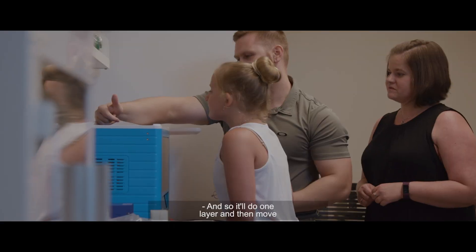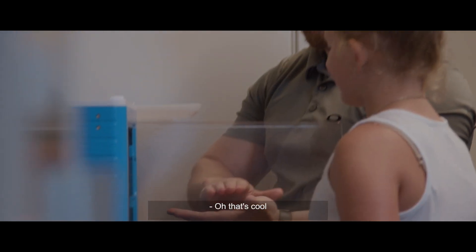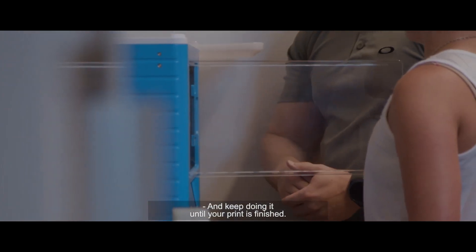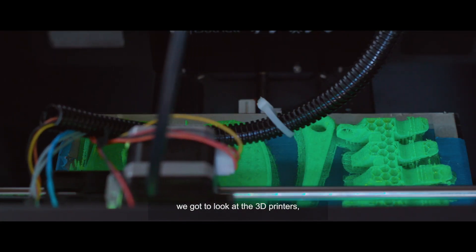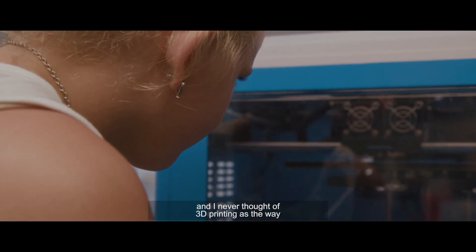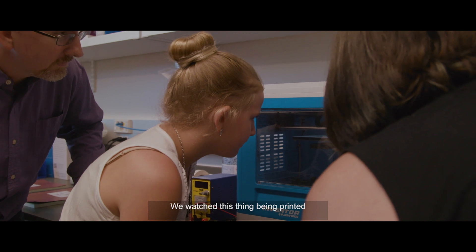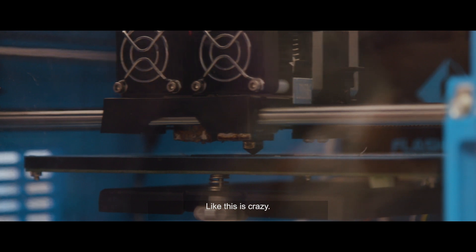It'll do one layer, then move the plate down just a little bit, then do the next layer, and keep doing it until your print is finished. In our first meeting with Michael we got to look at the 3D printers — he was showing us something being printed and I never thought of 3D printing as the way this was gonna happen. We watched these things being printed and were like, oh my gosh, that's gonna be it — this is crazy.